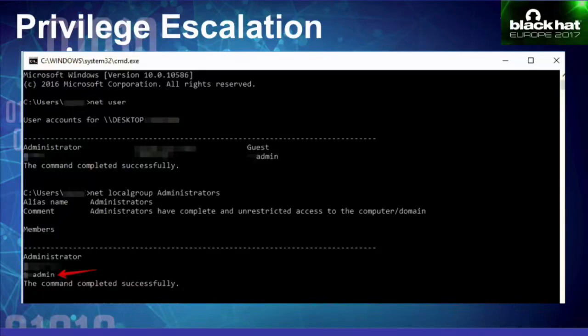So first of all, we installed Wireshark. So we started to explore network traffic. We spent a few hours analyzing that, but there wasn't much in there because all the data was encrypted. After that, we installed the Windows Sysinternals utilities. So we installed Procmon. Procmon was originally part of the Windows Sysinternals utilities, and it allows you to monitor any process-related, thread-related, file activity-related, and registry-related activities. So file reads, file writes, threads, processes, etc.